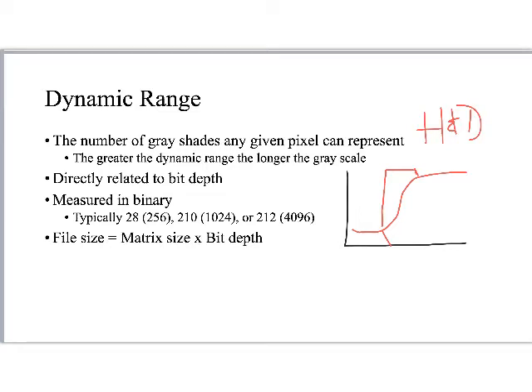This was very, very helpful, especially in film systems, because in a film system, the shoulder portion, beyond the shoulder portion, was the limits of the dynamic range. So the dynamic range was very much this area right here, and nothing above that or below that. Anything below that, the image would be unexposed, it would appear white. Anything above that, it would be overexposed, it would appear black.